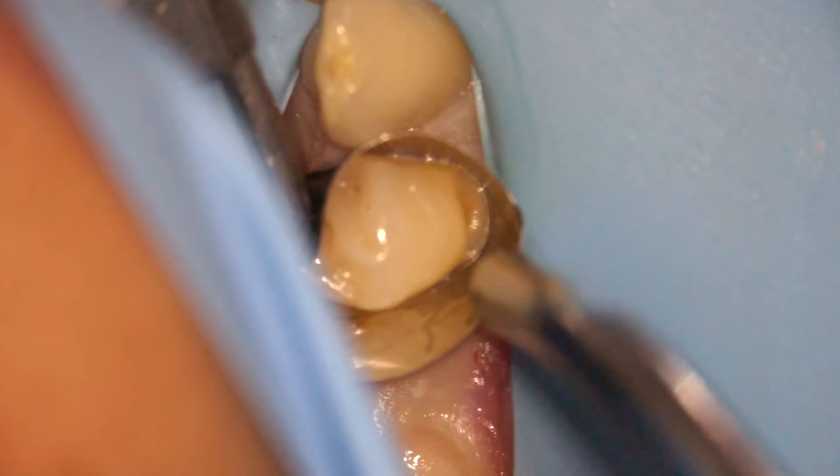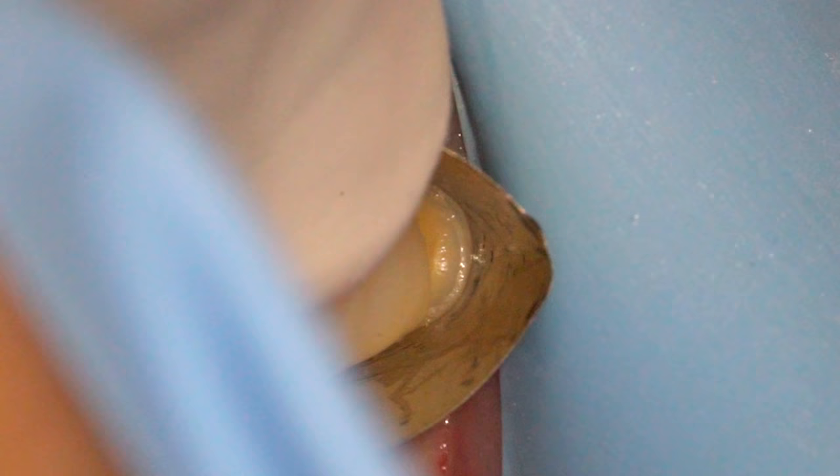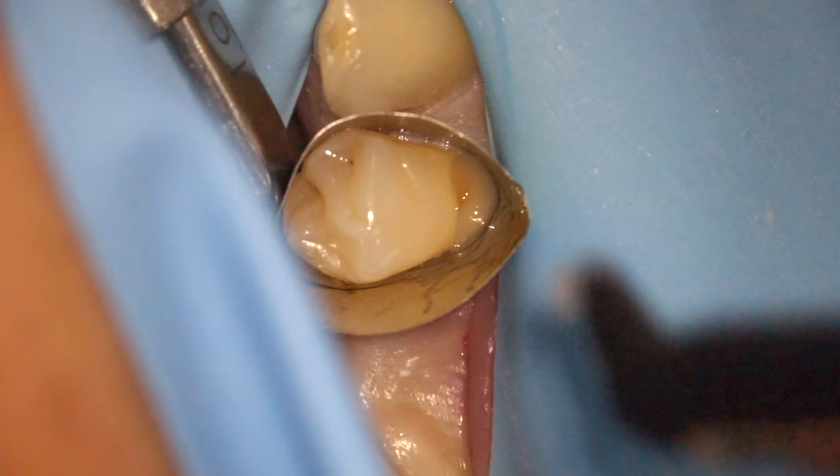We go through our bonding protocol — which you can check out in the video in the top right corner — and once that's done we can start putting the filling in. I'm going to use a flowable filling material to seal the bottom part so that I don't have to be holding the band the whole time, otherwise it tends to flop right off. We shine our light on that and it makes it hard, which then secures our band in place.